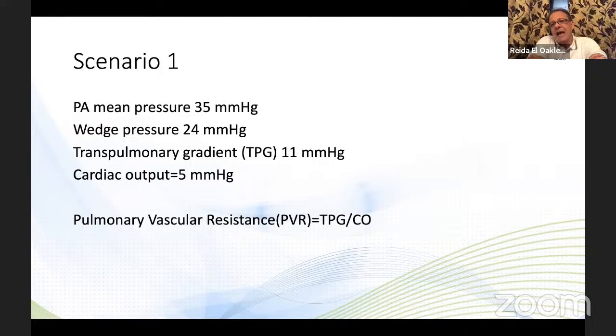Really, the question I have is somewhere maybe related, but maybe somewhat distant. And I think Adil has alluded to it, that the use of right heart catheter in cardiac surgeries has been abandoned by many centers. I don't know how far you guys working in the West now will have access to the latest regarding the non-invasive methods of assessing cardiac output.